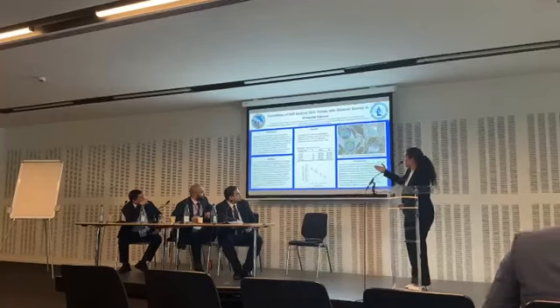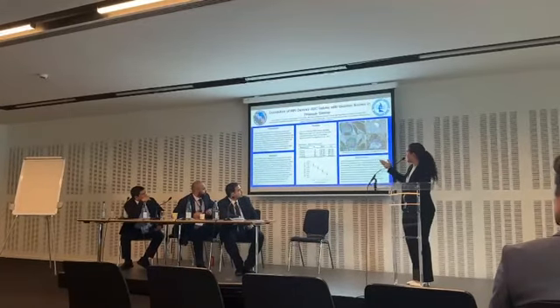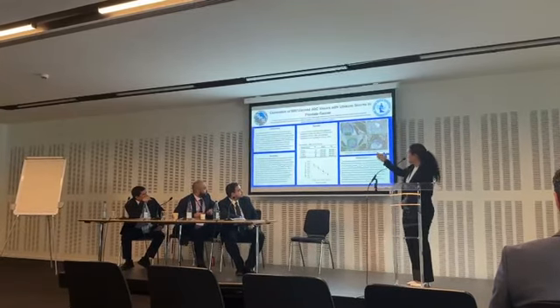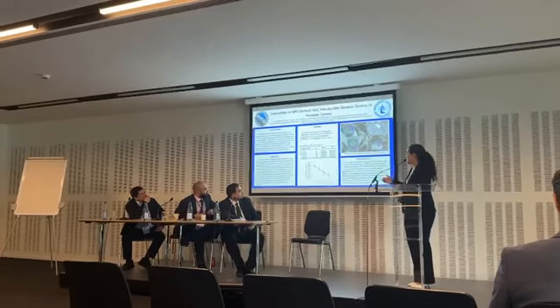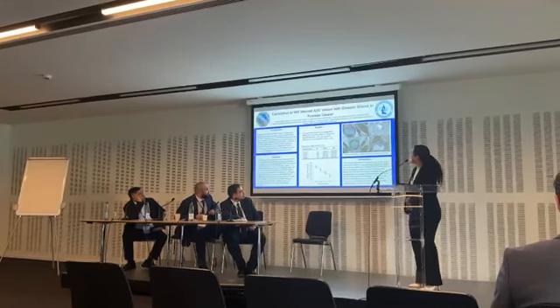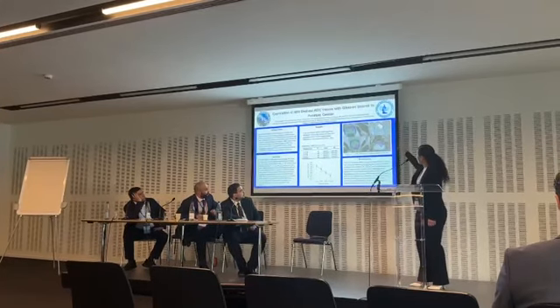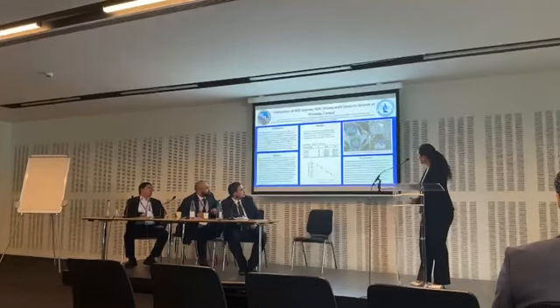For example, for the 4+3 or 4 and above, the mean minimum ADC value was 222, and then for low-grade cancers, for example, 3+3, the mean minimum ADC value was in the 450s micrometers squared per second. Up here you can see an example of a traced lesion where we found that the minimum ADC value in that lesion was 373, and the correlating Gleason score was 4+3.